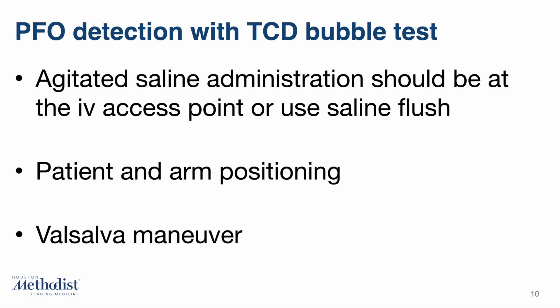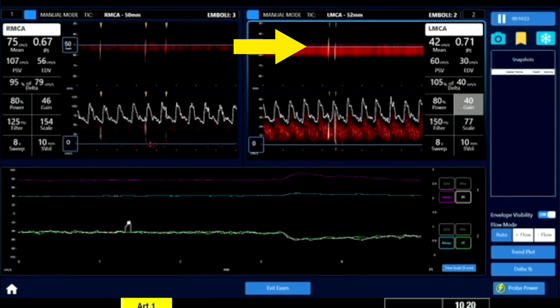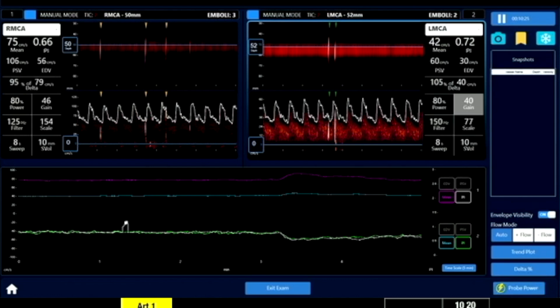Lastly, Valsalva maneuver with the respirator could not be performed because the patient had spontaneous respiration after the induction of anesthesia. Note, however, that the TCD bubble test was still sensitive enough to detect the PFO.